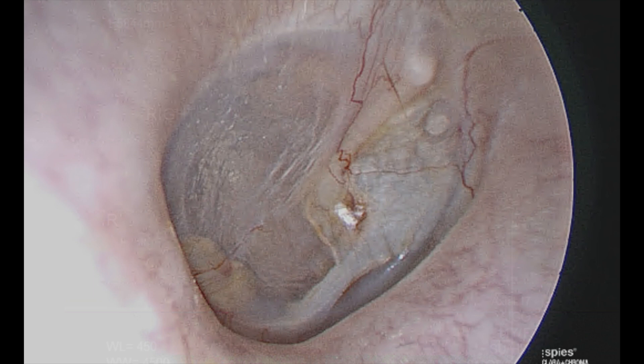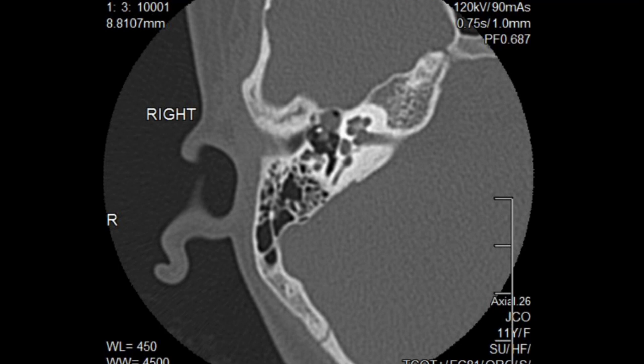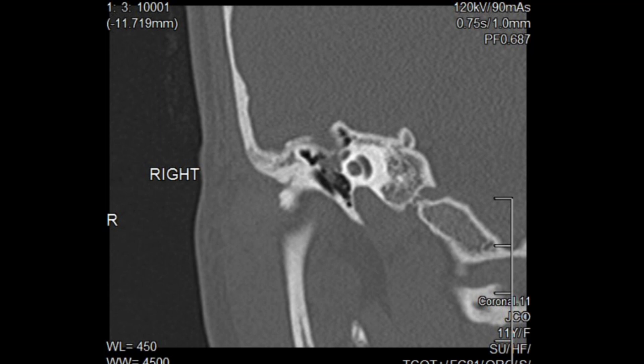On axial CT scan the lesion can be seen abutting the tensor tendon and over the region of the geniculate ganglion, and on the coronal images from anterior to posterior it can be seen next to the snake eyes just here.